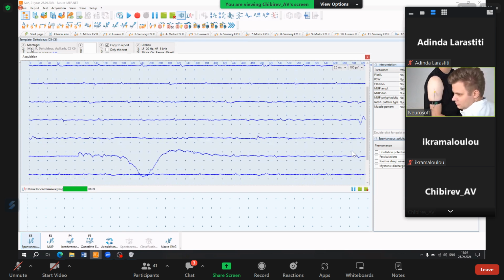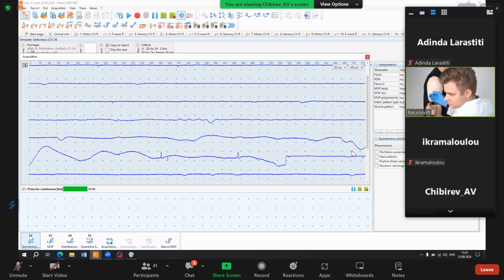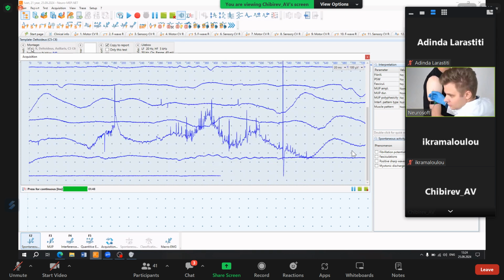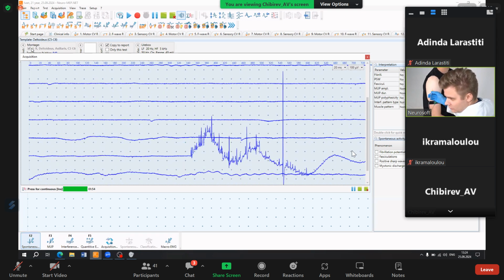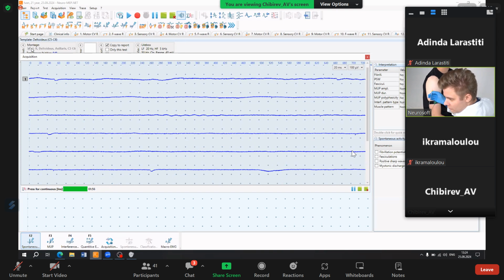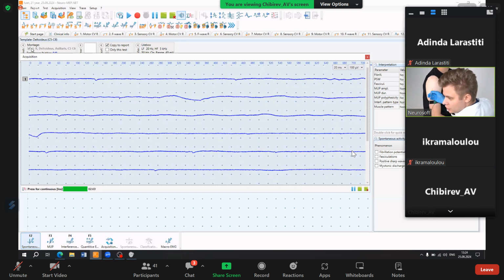Relax your muscle. You can see a forest of discharges. It's because the patient's muscle isn't relaxed. We have different ways to distinguish voluntary potentials from spontaneous ones, but sometimes it may be challenging for the doctor.